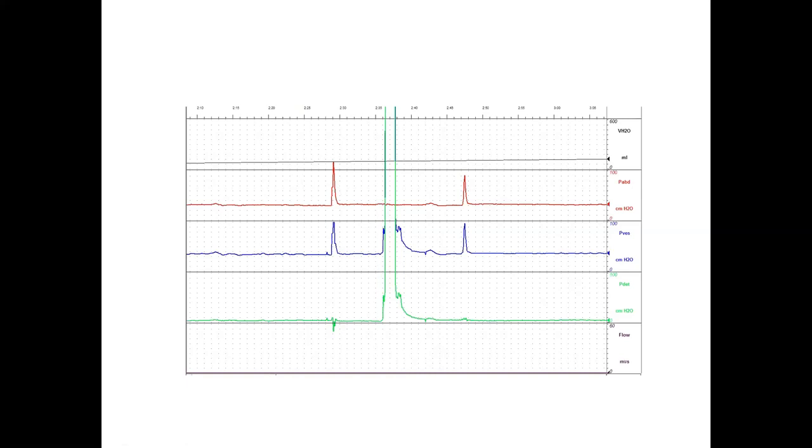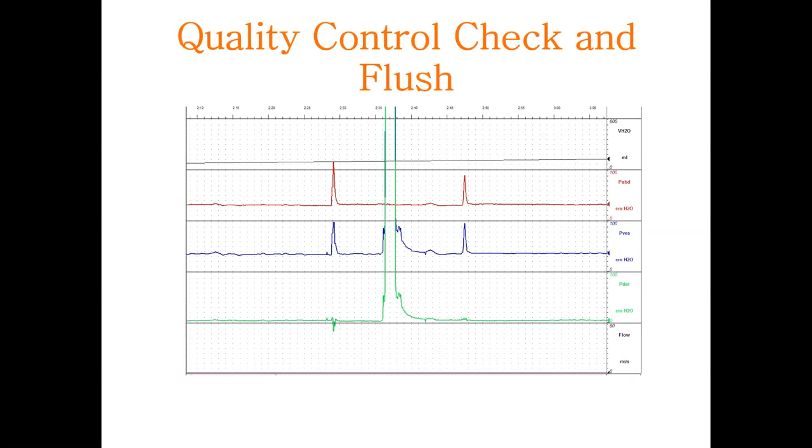There's no point doing anything in terms of a remedial action if you're not going to check it. So you've had an issue, you've troubleshot it, you've worked out which line it is, you've performed some form of action to try and remove an air bubble. That's what you're thinking it's likely to be if this is dampened. And the outcome is a lovely cough test with almost no response from your detrusor line. And then you can continue.